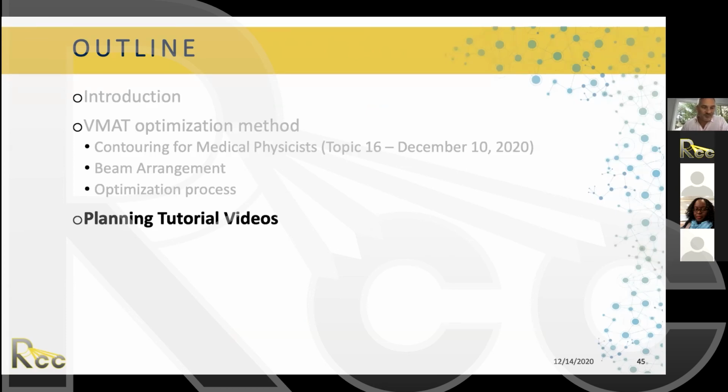Somebody asked, why use 200 priority? Is it subjective? And furthermore, is the priority only relative to every other priority, or is there a fixed number they compare to? Yes, very, very good questions. The priorities all depend on each other. It's not a fixed value that you work with independently. They all correspond to each other.